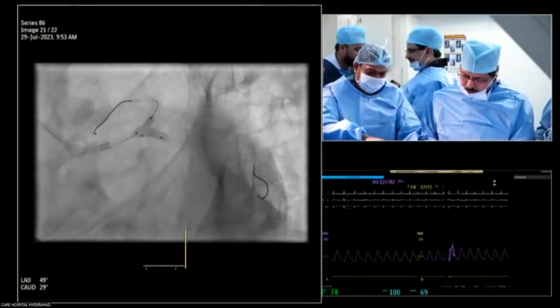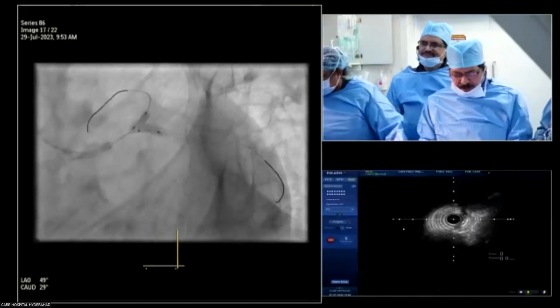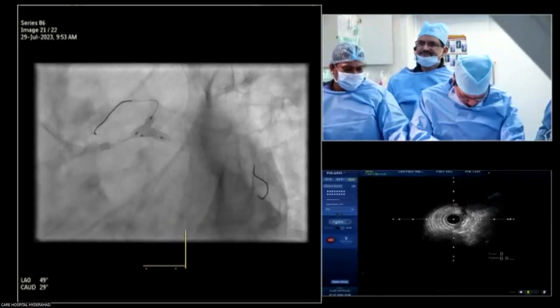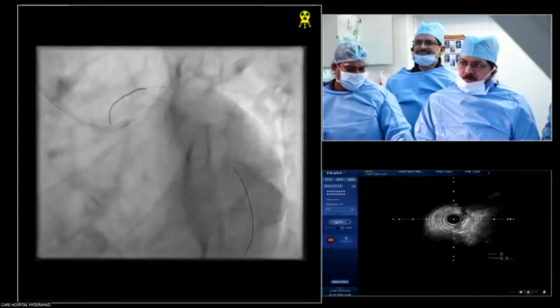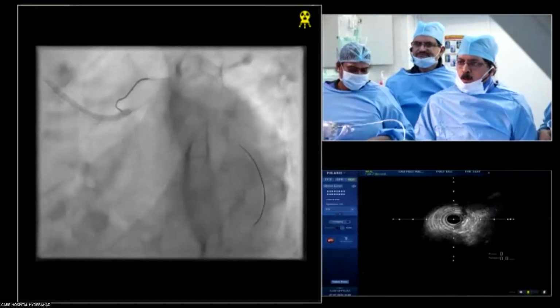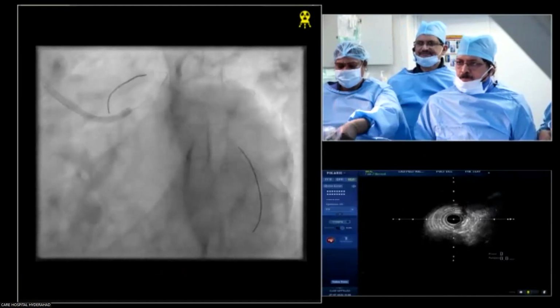struts into the left main complex. When you do one or two stents into the left main, I don't think it causes any problem, but we crushed that also. It extended slightly into the confluence. Definitely the struts are projecting into the confluence based upon the IVUS. Otherwise, the stent is very well expanded. The landing zone is very good and healthy, but it is projected and encroached onto the LAD ostium. With kissing, definitely it clears.